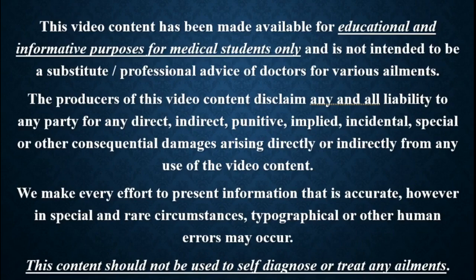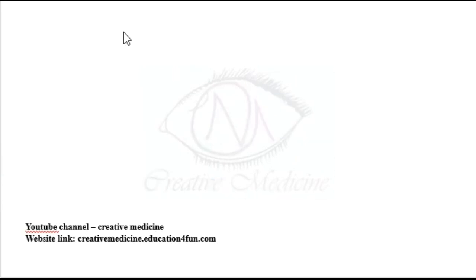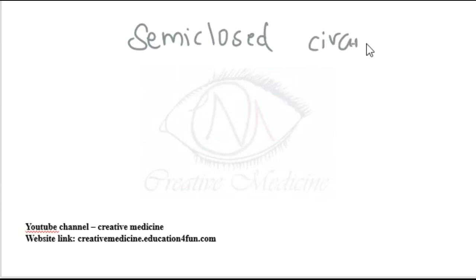In this lecture, we will learn about semi-closed circuits. In semi-closed circuits, first we will see breathing circuits. Breathing circuits are the tubes which connect anesthesia machine outlet to the patient for the delivery of fresh gas flow.